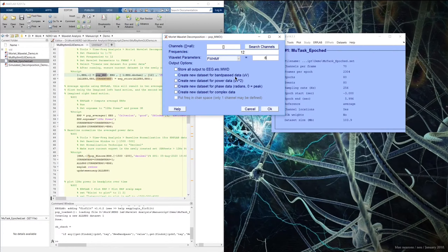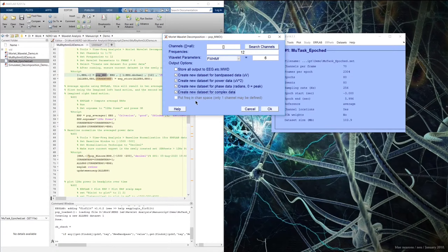Now, how do we want our convolution results to be output? Selecting the first option will store all the time series bandpass, power, and phase data in the original EEG structure's etc. field — this might be useful in some batch processing cases but will probably be rare, particularly in the GUI environment. The next few options will each create a new dataset. Each of these new datasets will be equivalent to the original in terms of event and channel structure, but the time domain data will be replaced with the time domain bandpass, power, phase, or complex data, with the new data unit shown.